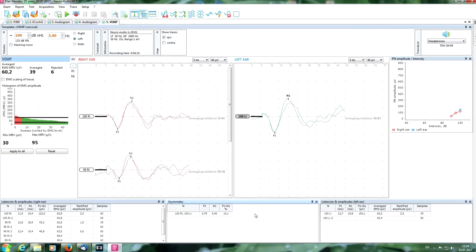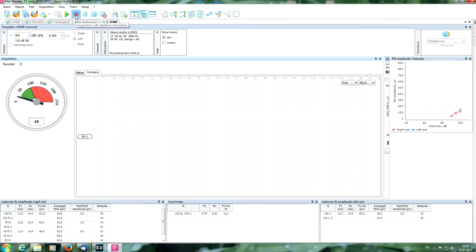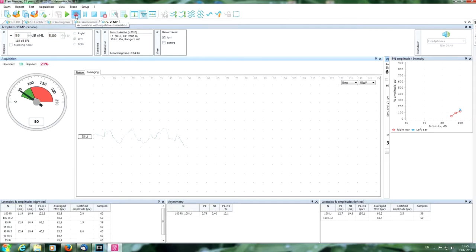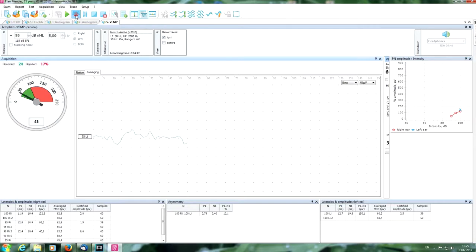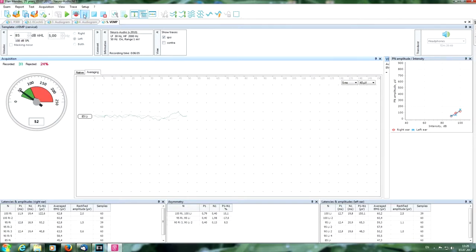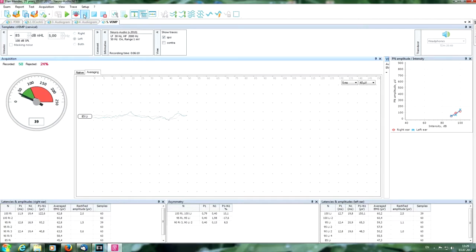Decrease the intensity and search the threshold. Here you can see the process of averaging. At 85 decibels we don't have a response.